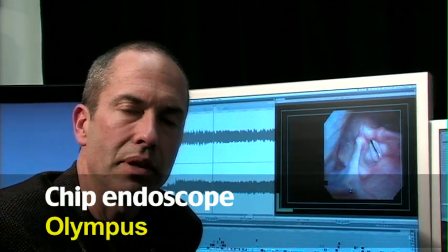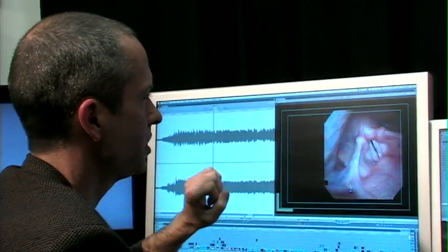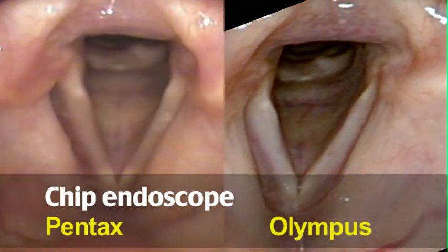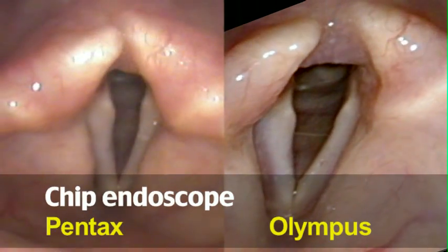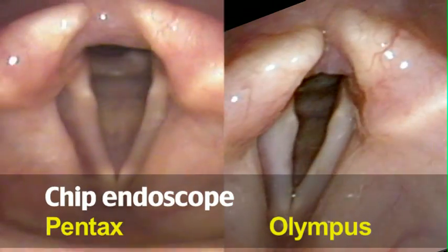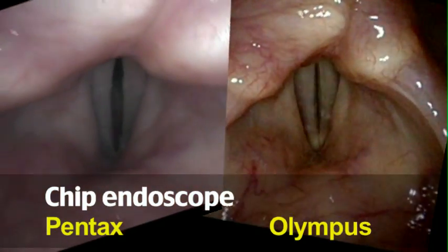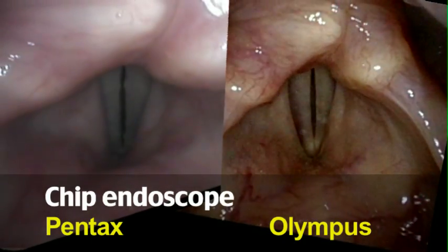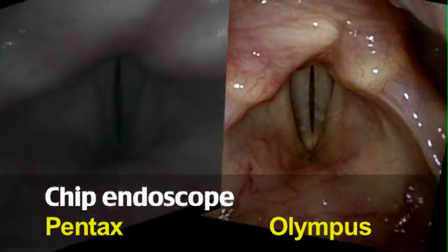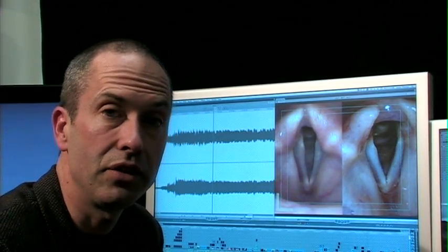When Olympus came out with their chip endoscope around the same time, I found they didn't use as much of the screen real estate, so the image was smaller and a little harder to see. This year they brought out a chip endoscope with an image very comparable to the Pentax. There is a light quality difference — the Olympus tends to emphasize blood vessels more, so the images tend to look a bit redder. The engineers at Olympus have taken advantage of that and adjusted the light so that blood vessels stand out in stark detail.